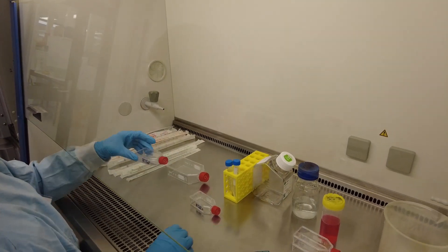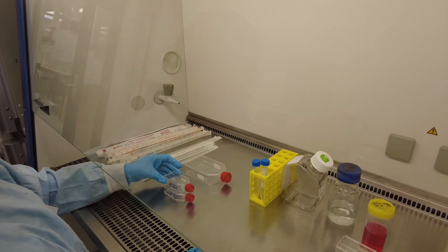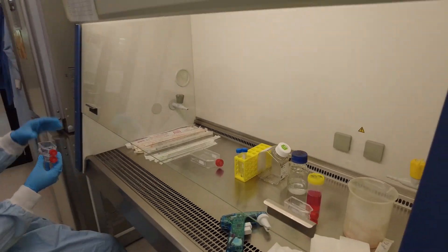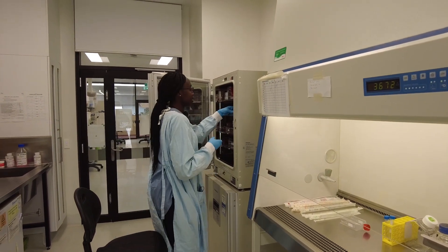Make sure that the trypsin covers the bottom layer of the flask. We're going to put it into the incubator for about 5-10 minutes. And then we'll be back so we can split the cells.